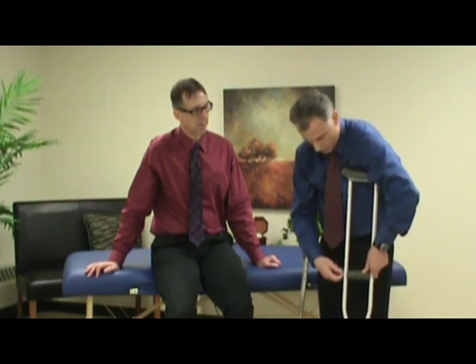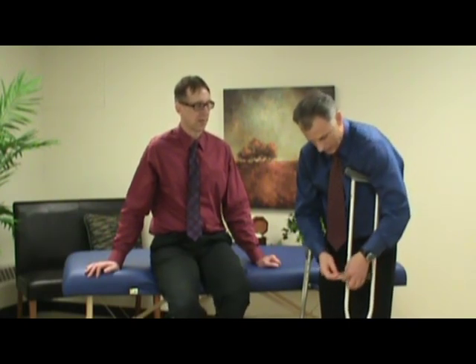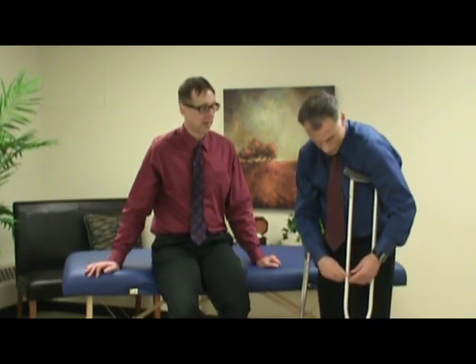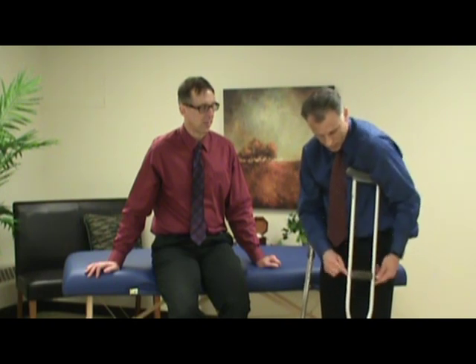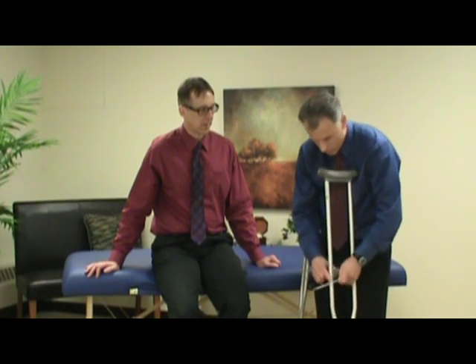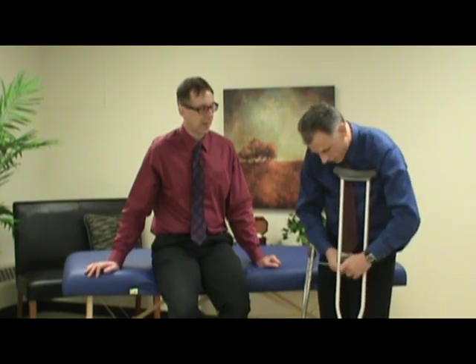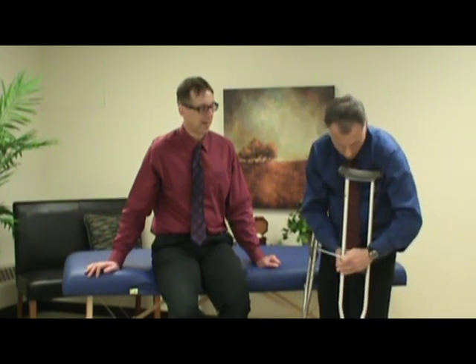You've got to take this all the way off. Yeah, it's not an easy thing. Actually, this is kind of where you say, oh geez, I've got to do that too, but you've got to do it. This is the one that you're going to spend a little time on. You pull that out, and of course there's a hole in there. You can look in there like that. It's kind of like a little telescope. It's kind of fun. If you've got kids you're adjusting it for, they enjoy that.